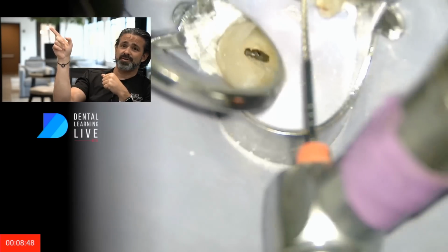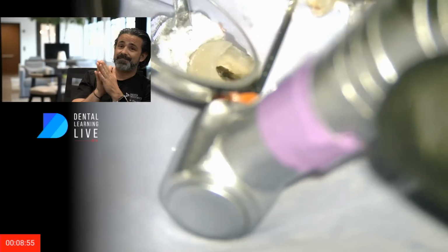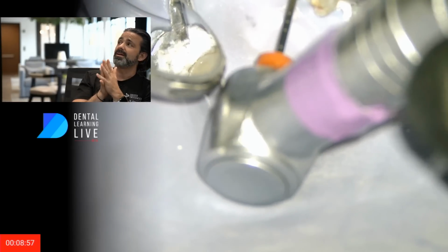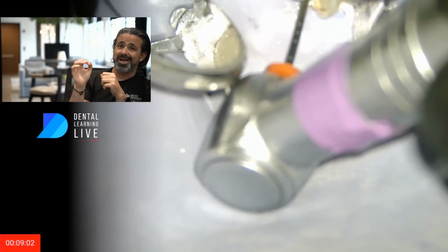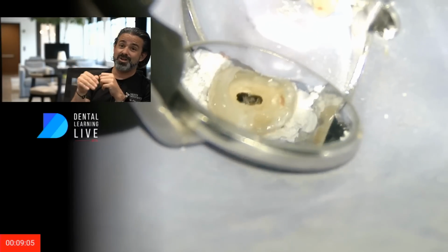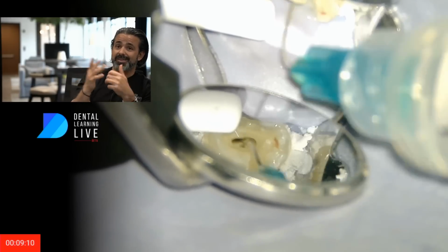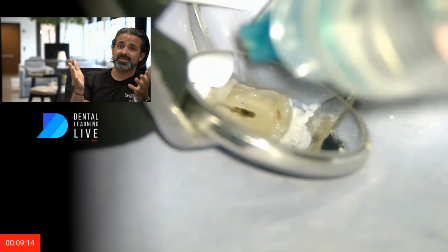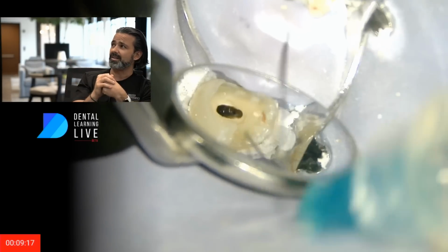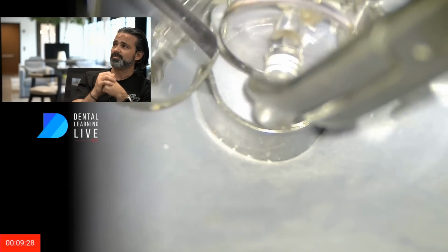Now I switched it to a 1504, and it's kind of a crown down technique. I'm trying to be conservative. I'm trying to use smaller files, but I can feel that file working and bending in there. And it is making me nervous. You can almost sense it with the tug back as I pull it out, as I'm trying to paint stroke it up. I do not want to lose a tip on this thing. Another option would be to go back with hand filing, but again, time is also of the essence in a busy practice, which my practice is fairly busy. We have 3 doctors in our practice, and we're running multiple rooms.